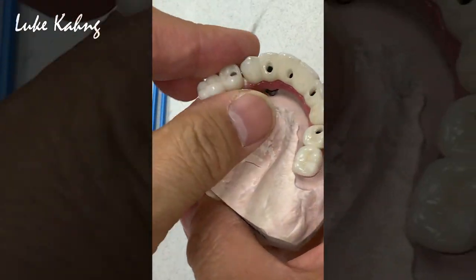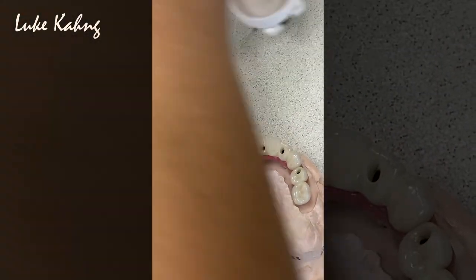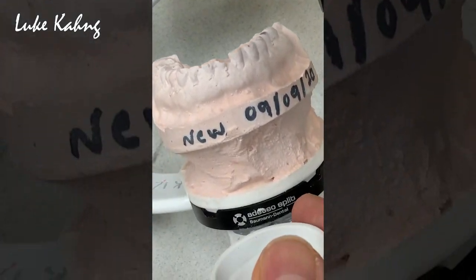And then here is the tooth, separate. So all monolithic, we fabricated. And then initially, the patient had a problem with the occlusion. You see, all low. Of course, the patient's not going to give up.